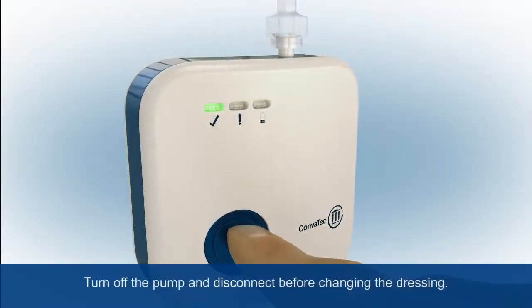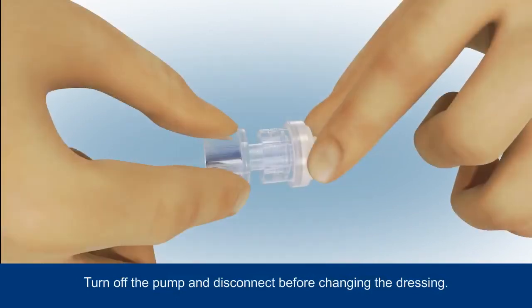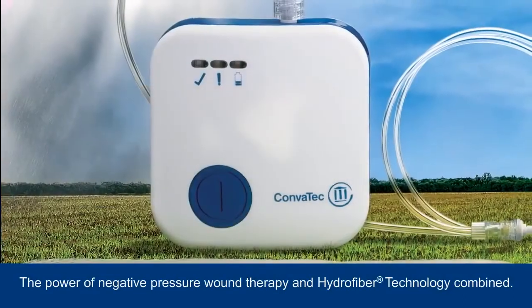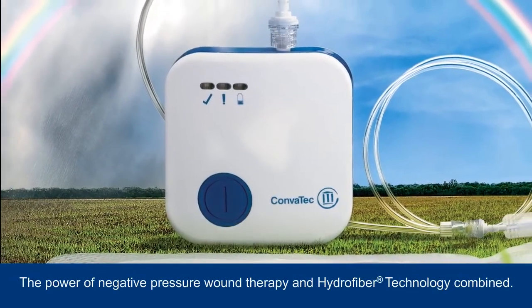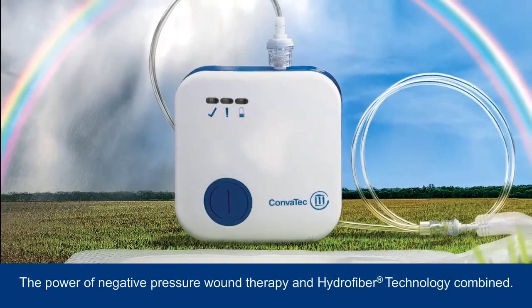To change the dressing, turn off the pump by pressing the blue button before disconnecting the tubing to isolate the pump from the dressing. Carefully stretch the fixation strips away from the skin before lifting and removing together with the dressing. The innovative system brings together the power of negative pressure wound therapy and hydrofibre technology, which is designed to help create a moist wound environment for healing.